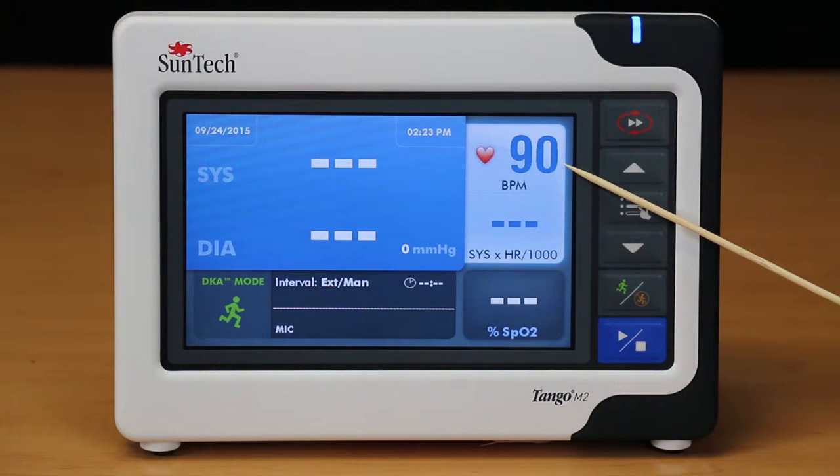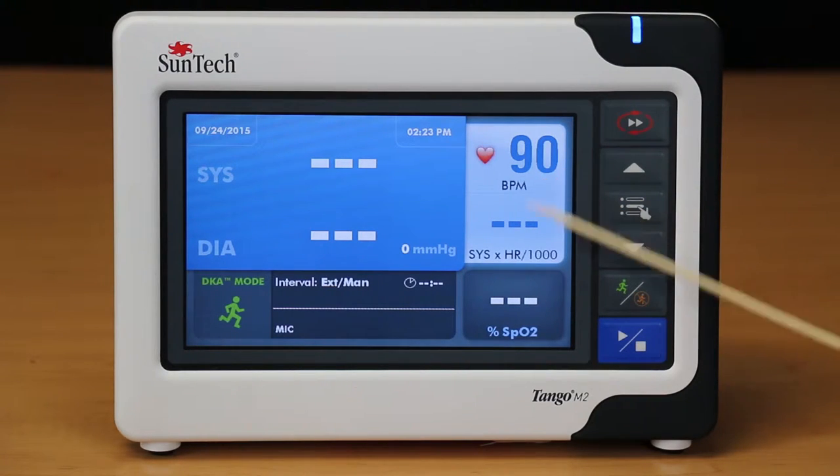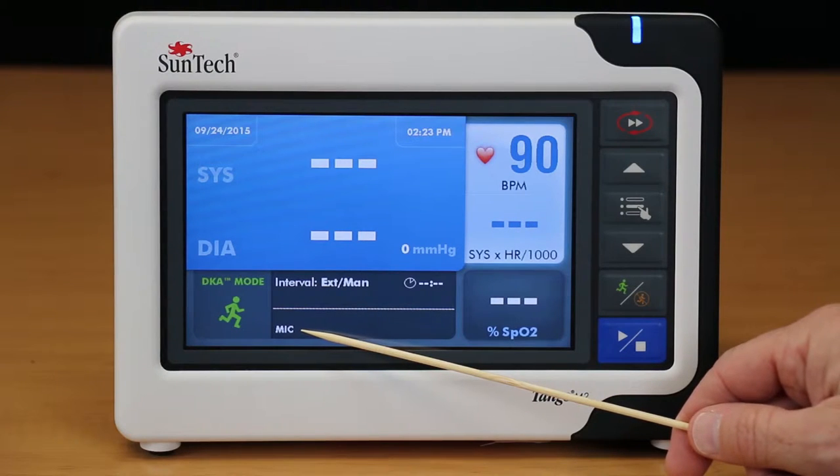To trigger this, simply begin the stress test and verify that a steady heart rate reading is now showing on the monitor. Once you have verified that this is working properly, it's important to check the RS-232 communication. If the Tango M2 and stress system are properly communicating, you will see a small white dot next to the word Mike at the bottom of the Tango M2 screen.